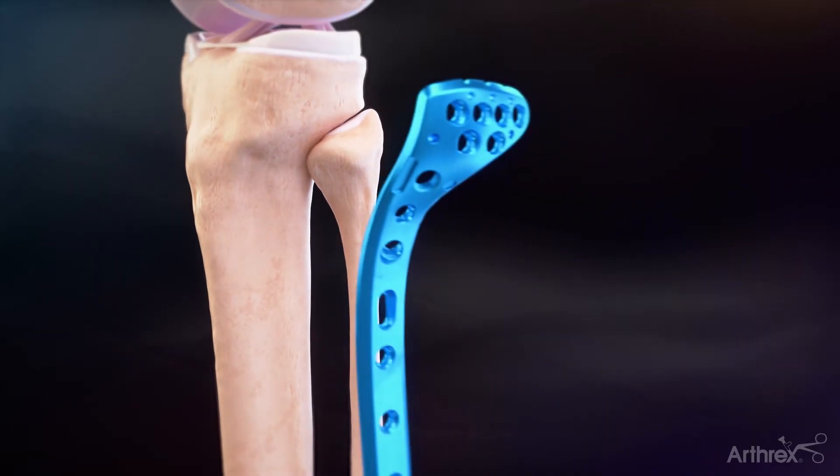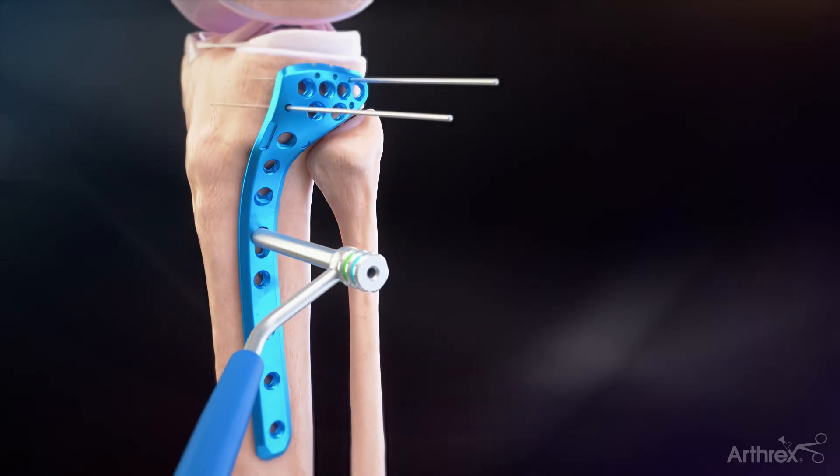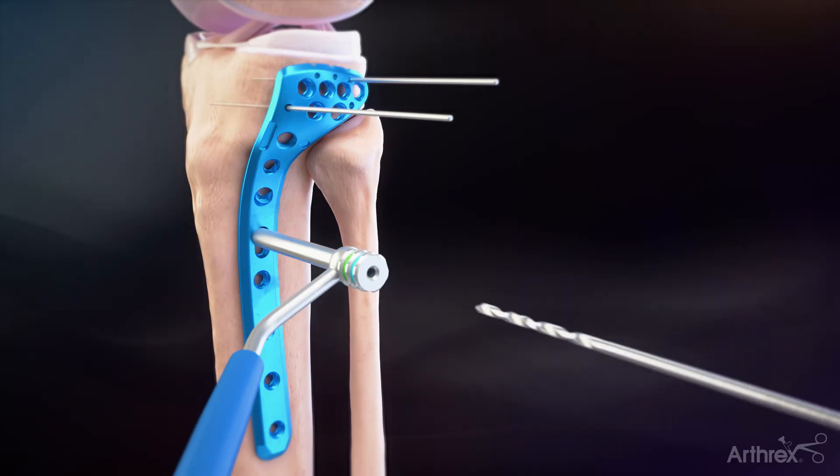For the lateral plate, a similar technique is used. The variable angle drill guide is used for 3.5 mm cortical or 3.5 mm variable angle locking screws.